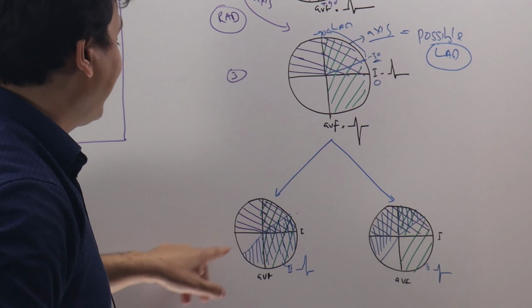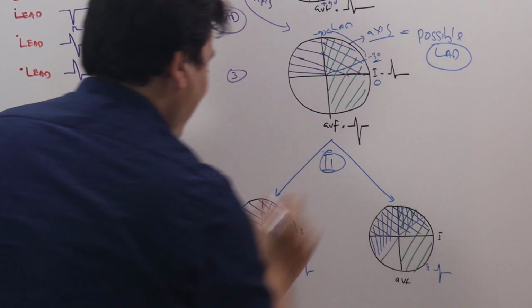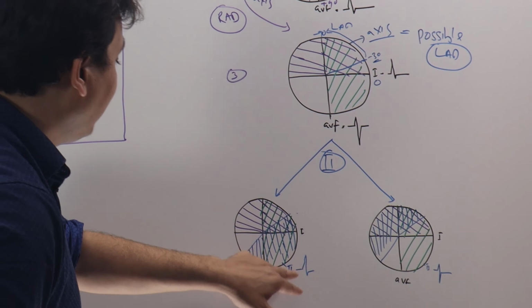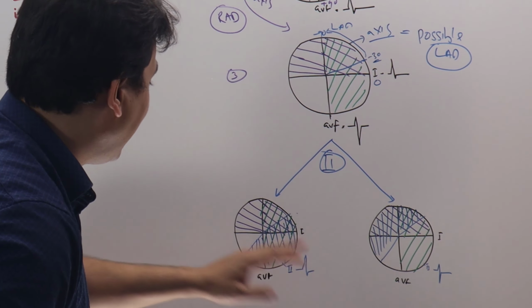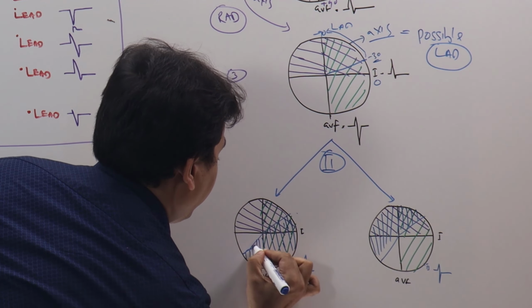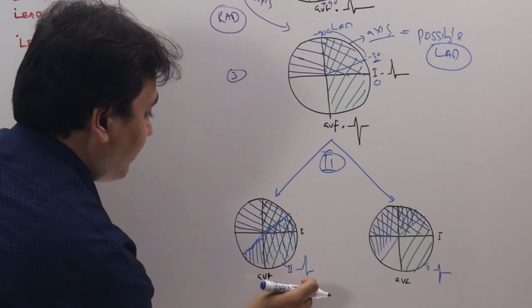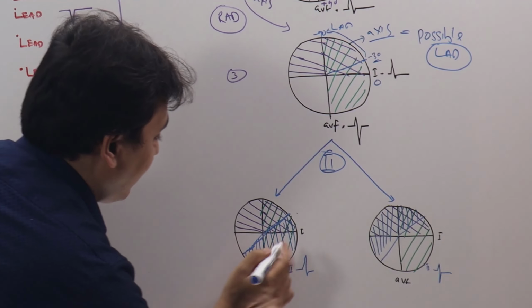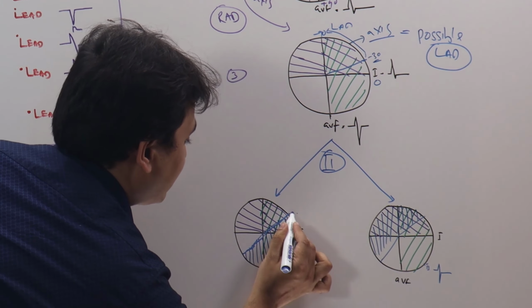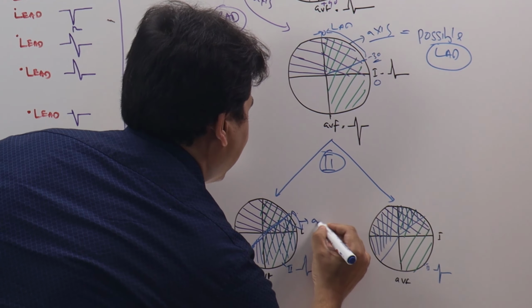That you can do by checking lead 2. Lead 2 is positioned in the left foot. If lead 2 is positive, that means the cardiac axis lies below this line. Otherwise, if it is opposite to this line, it will be predominantly negative. Now because it lies below this line, the cross section of the 3 leads, which is this area, is actually called the axis.